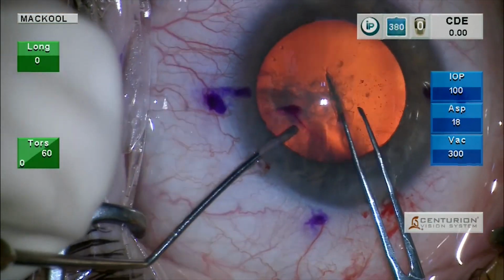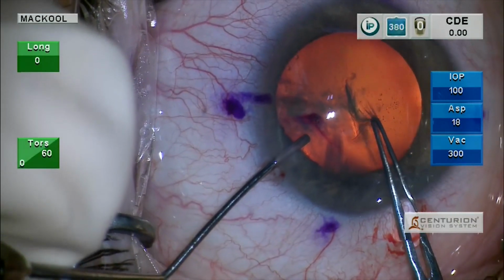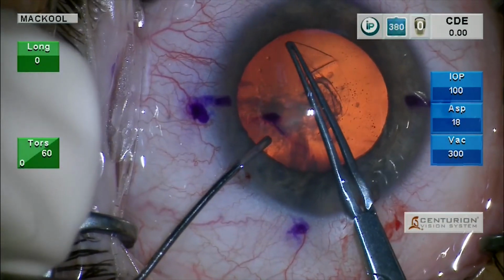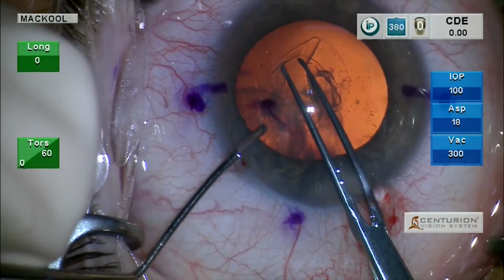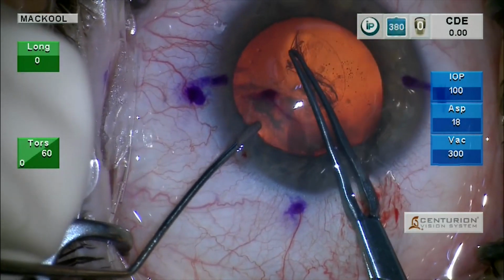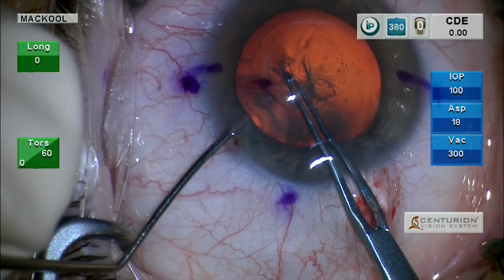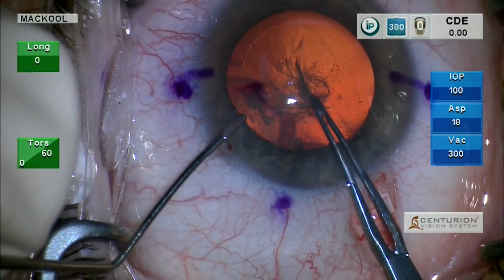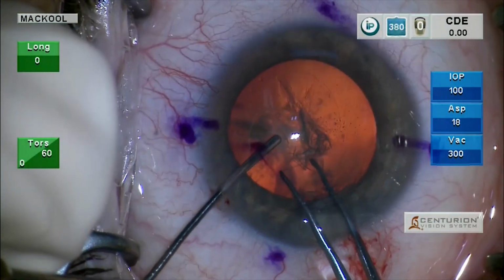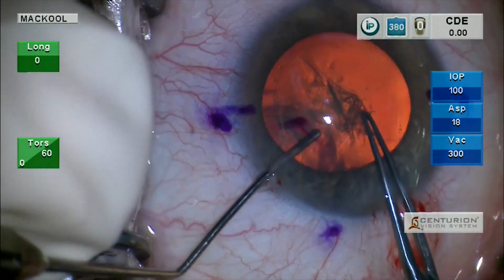So the spatula is holding this eye where I want it to be, and it can't really move as I do this capsulorhexis. So we start out on the rhexis, head out as far as we want to be, and now we make the turn, because that is the distance that I would like this capsulorhexis to extend from the center of the eye, and then we follow the pupillary margin. And all the time we're holding the eye still with our second instrument.